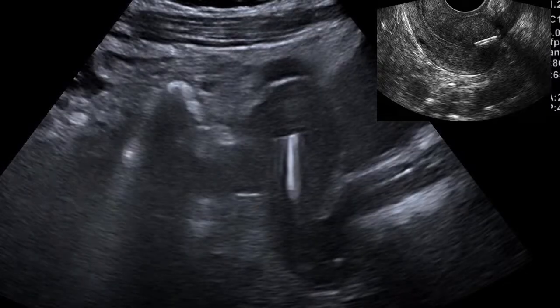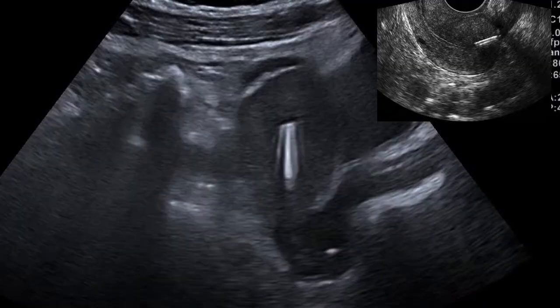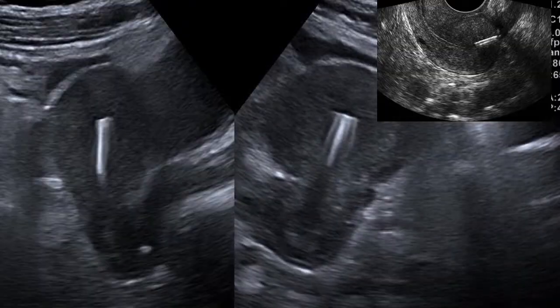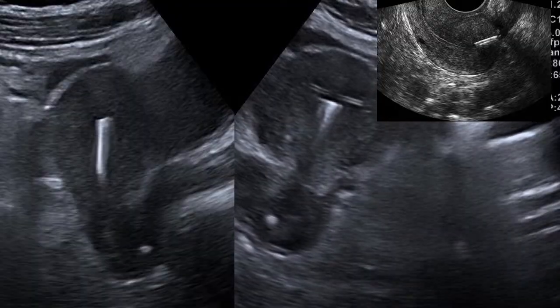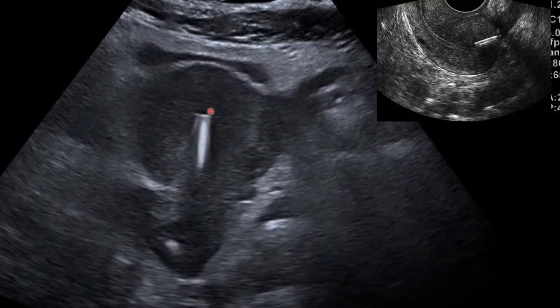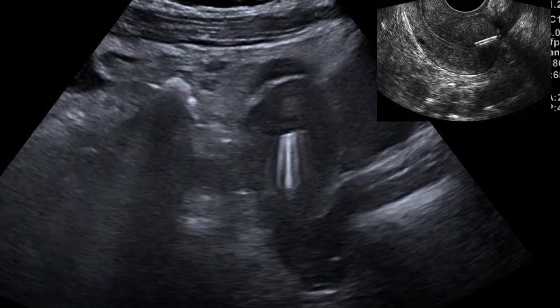On ultrasound, as you can see, I used transabdominal. It was good enough, so I didn't need to show you the images that I later did, or to demonstrate the ovaries. Here you can clearly see the IUCD. You can see it nicely there, and you can appreciate that the surrounding areas are looking very okay.